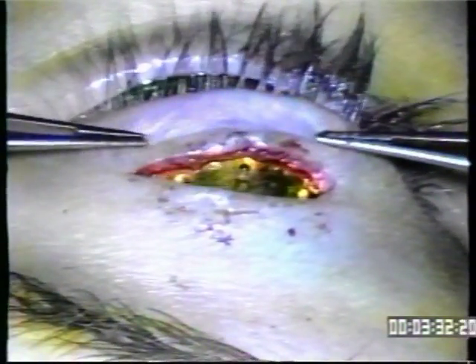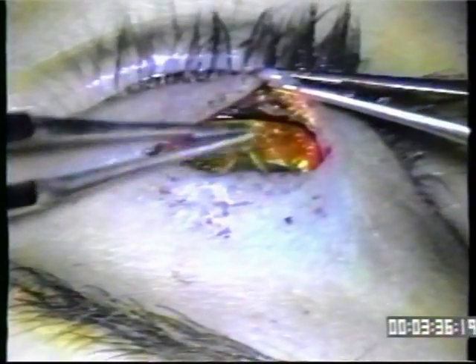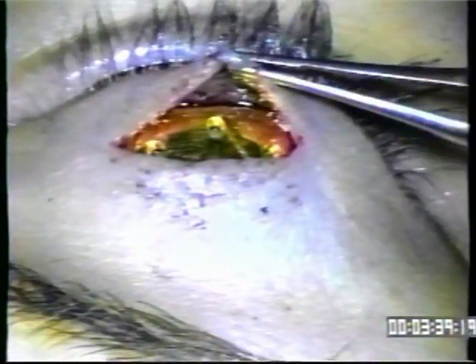The gold is lying directly on the tarsal plate, three millimeters above the lash line and up against the orbital septum. Now using 8-O ethilon we'll place it through the hole in the lower portion of the gold. We start from the top and work our way down.